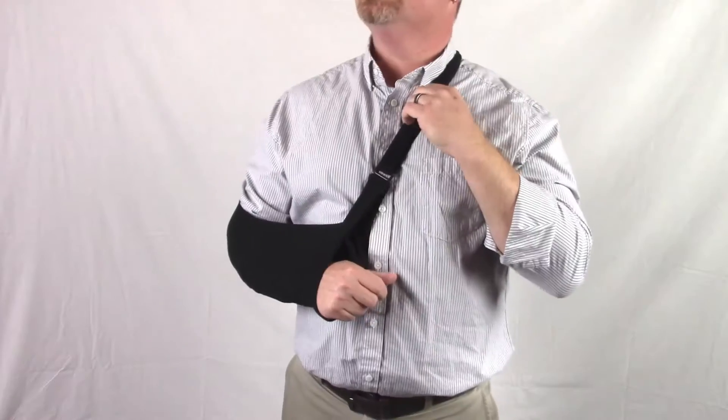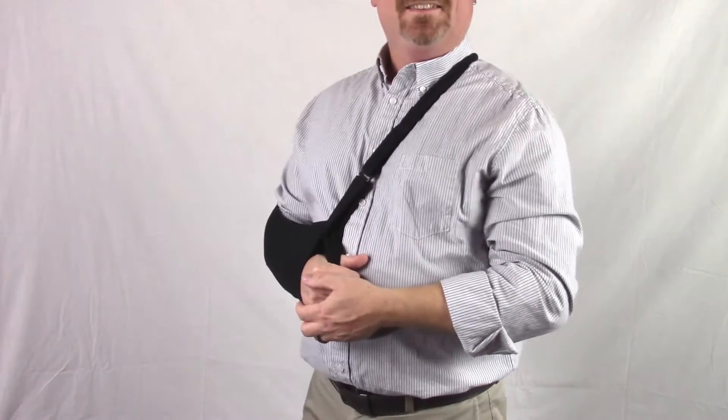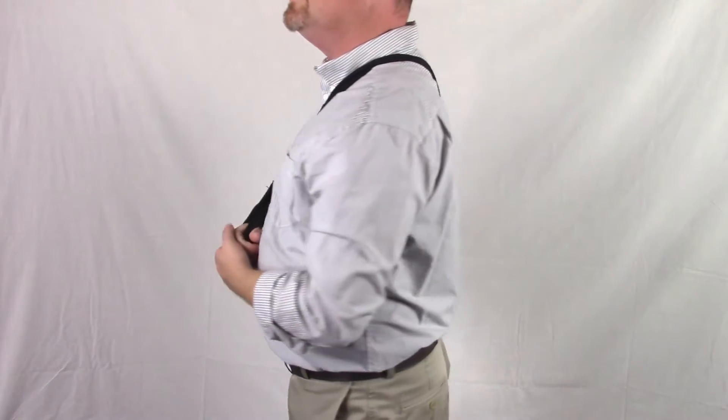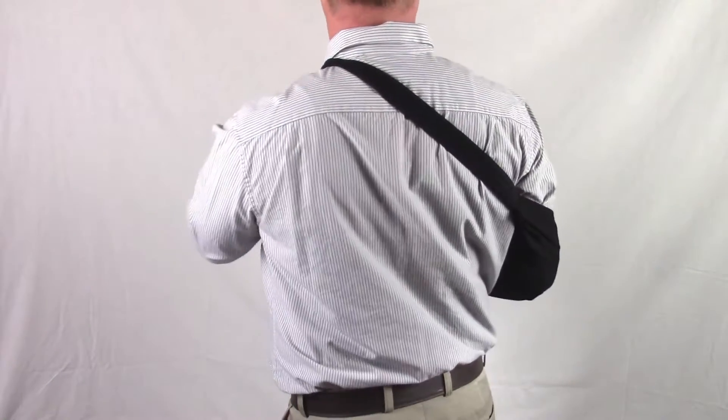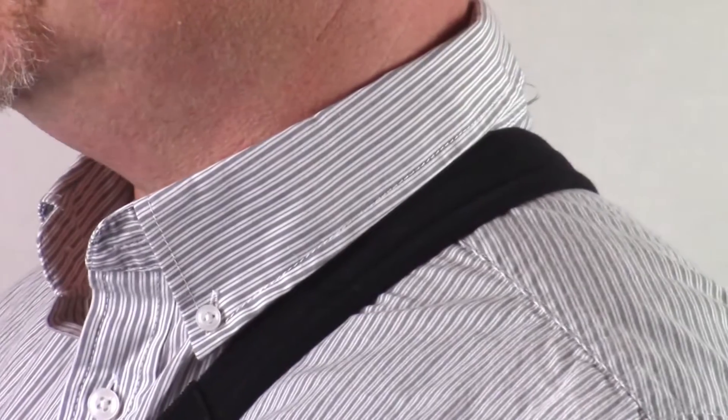Whether your arm requires a higher or lower position, the Jocelyn Ultimate Arm Sling will adjust to your needs. Since the arm sling only moves at the base during walking and other movements, stress on your neck muscles is dramatically reduced.